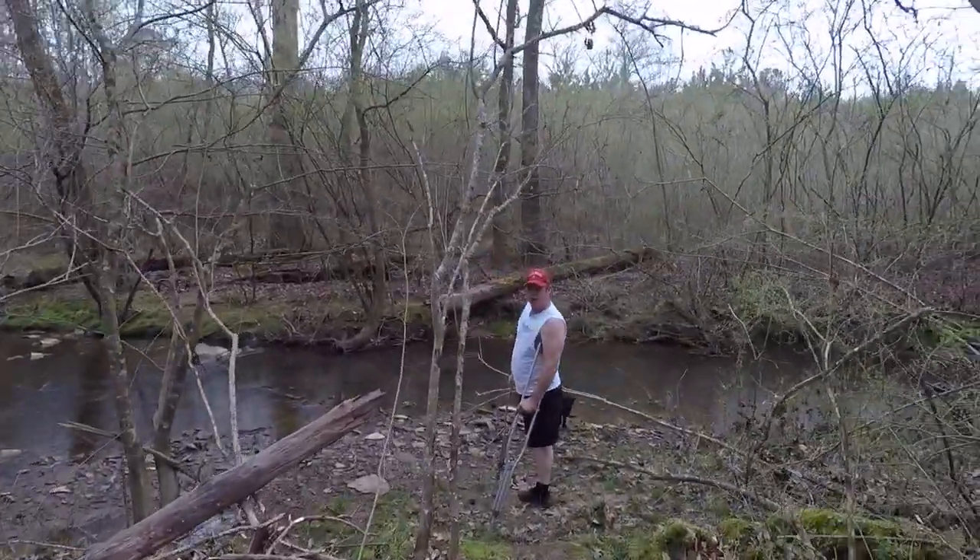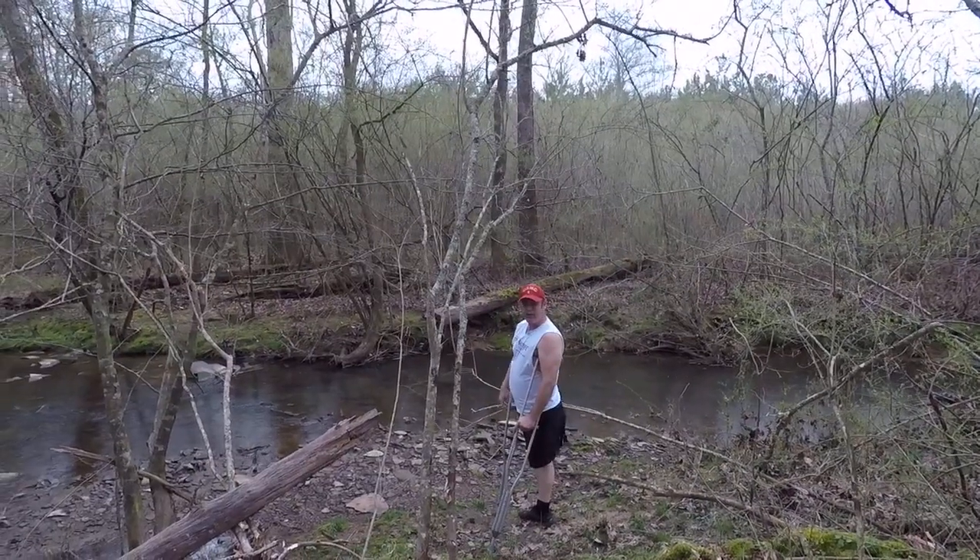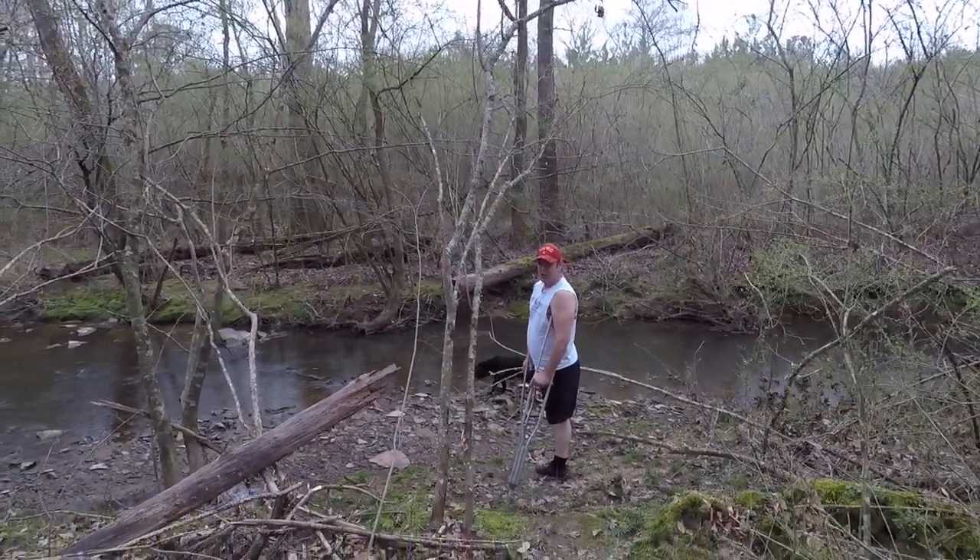Now, when crutching across streams, you've got to be careful. Rocks are slippery — just take your time. Let's go.